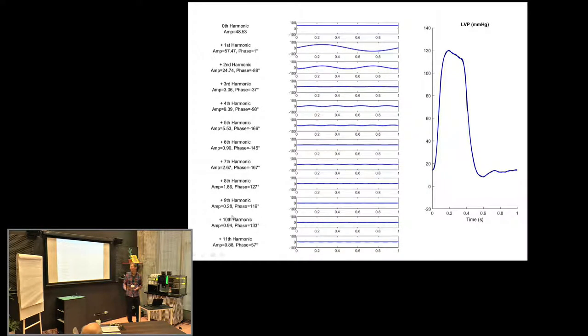Yeah. Right, that's typical for humans. What about mice? But at exercise, you need a higher frequency. True, you're very right. So when you have a high heart rate, like in the mouse, that has, we heard yesterday, 600 beats per minute, that's ten times what we have here. So the frequency content is at 150 hertz, so you need at least 300 hertz. So be aware of the heart rate.